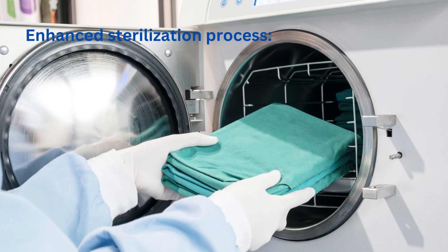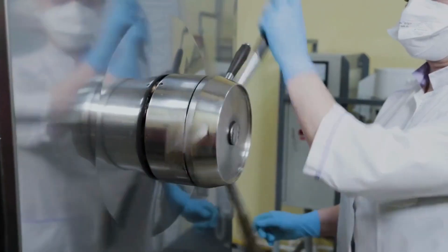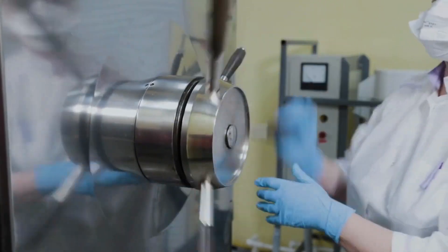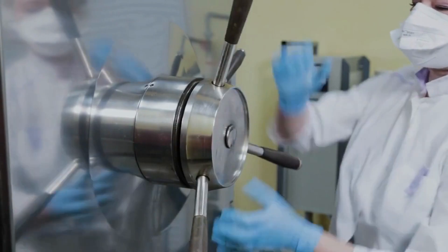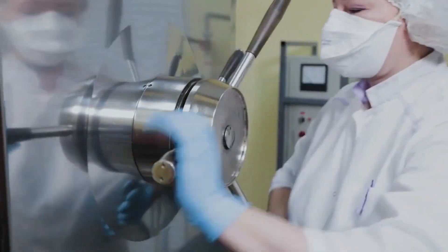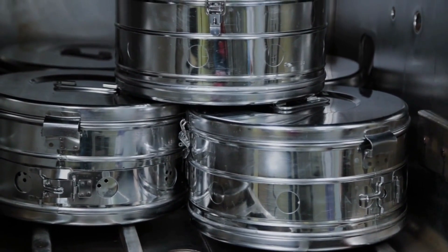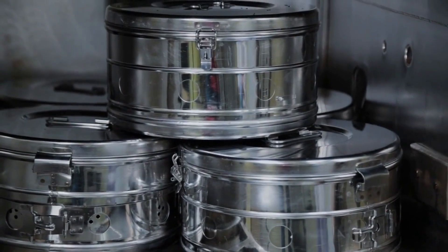Enhanced sterilization process: sterilization methods such as autoclaving, steam sterilization, or chemical sterilization work most efficiently on instruments that are free of organic debris. If instruments are not adequately cleaned before sterilization, the presence of contaminants may shield microbes from the sterilizing agent, reducing the efficacy of the sterilization process.